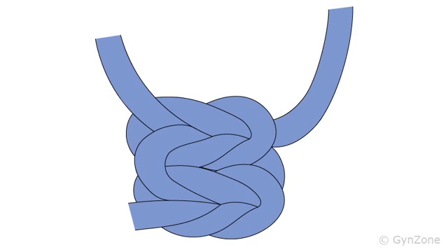The finished square knot locks itself. The more tension the knot is subjected to, the tighter it will be. This is in contrast to sliding knots or incorrectly performed square knots, which will get looser or released completely when exposed to tension.